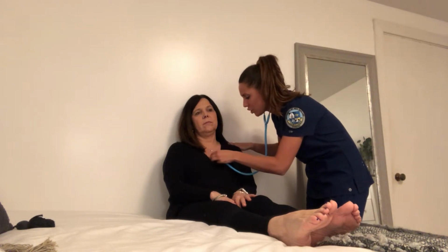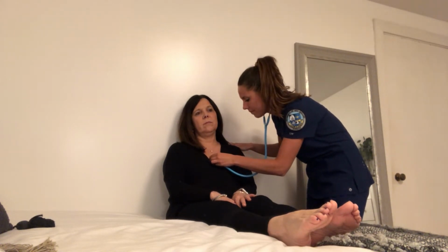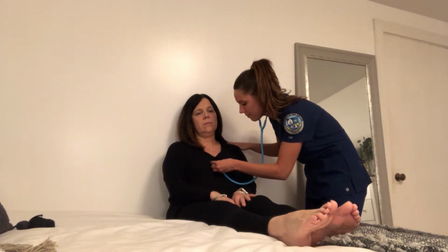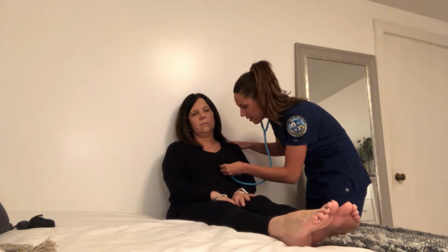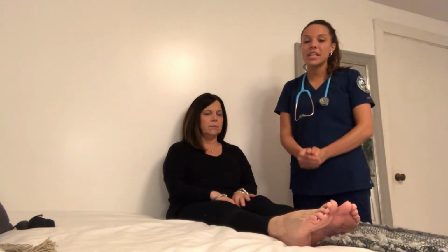Then we're going to move down to Erb's point. Then the tricuspid valve. And then the mitral valve. All right, patient presents with a regular rhythm, and S1 and S2 were noted in all 5 spots.